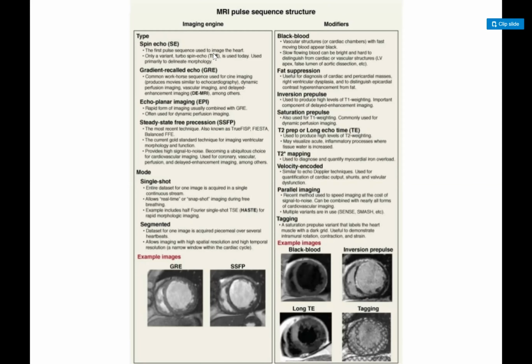So in the beginning of the imaging, you might see this image, which gives you an anatomy of the whole area that we are imaging. Then there's something called gradient recalled echo, and there are multiple types of gradient echoes. It does not have really good spatial resolution, but it's really good when the imaging has some issues with it. And we can talk about those issues later on.